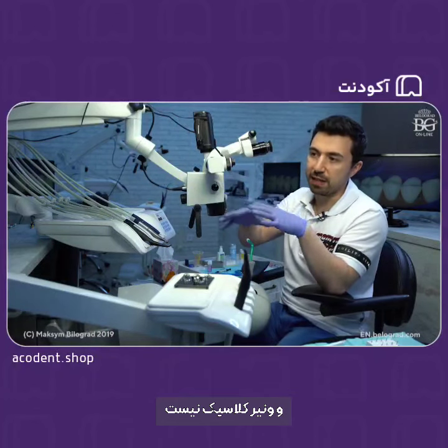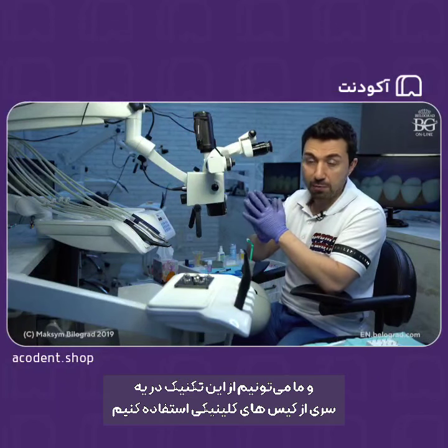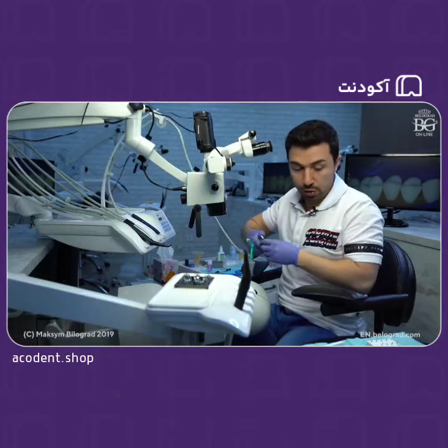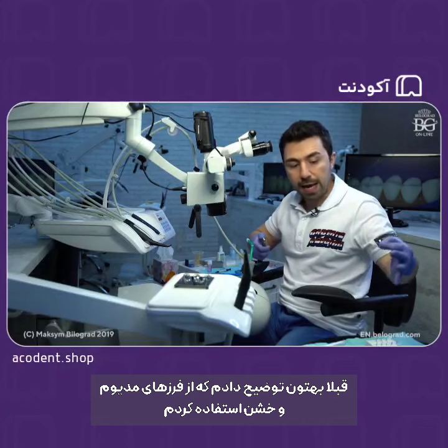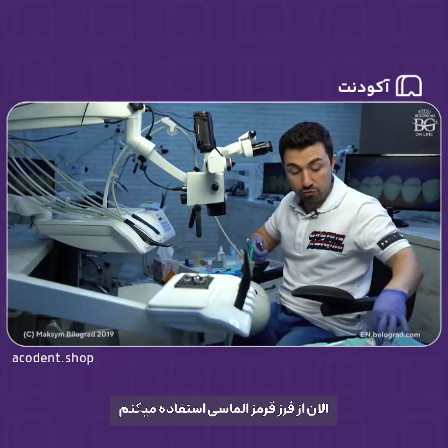It's not the classic veneer, it's the veneer overlay preparation, and we can utilize this type of prep in certain clinical cases. Okay, now we're going to have stage 2, and I'm changing the burr for the red one. So previously, I remind you, we were using medium grit burrs and coarse burrs. Now I will have my red diamond burr.